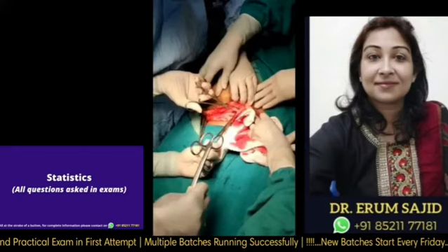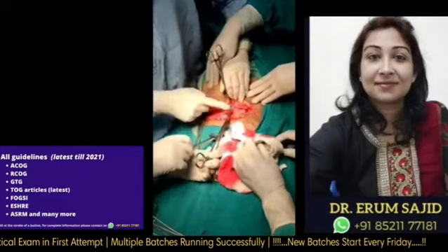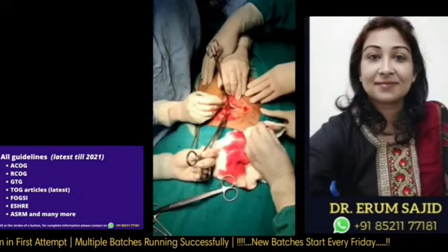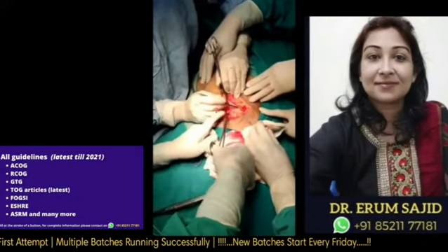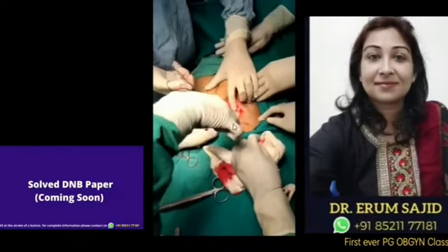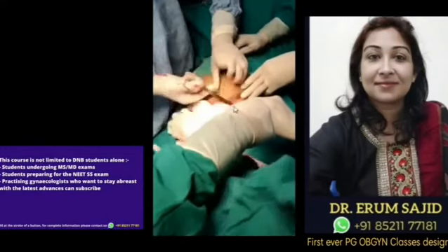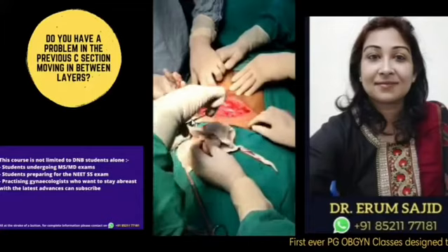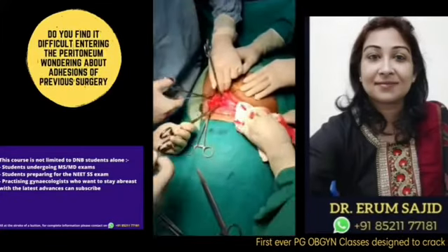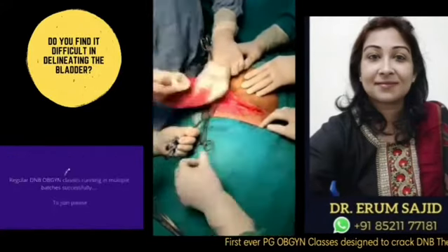So I'm trying to separate the muscle underneath, but I'm not successful. So I decide to do a very superficial, proper, sharp dissection and incise the rectus sheath, so that the muscles get separated. But the muscles will not get separated so easily. I've just incised the rectus sheath, but the muscles are still adherent to it. The adherent muscles have just gone down. They have not separated yet.